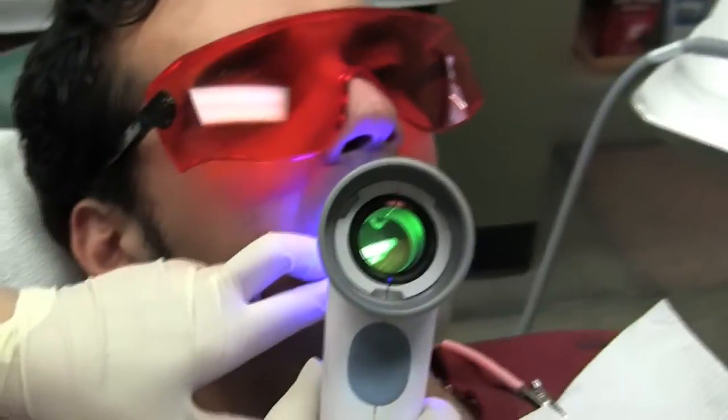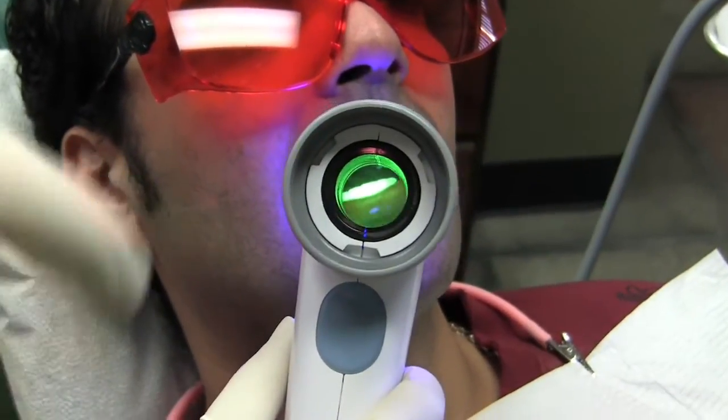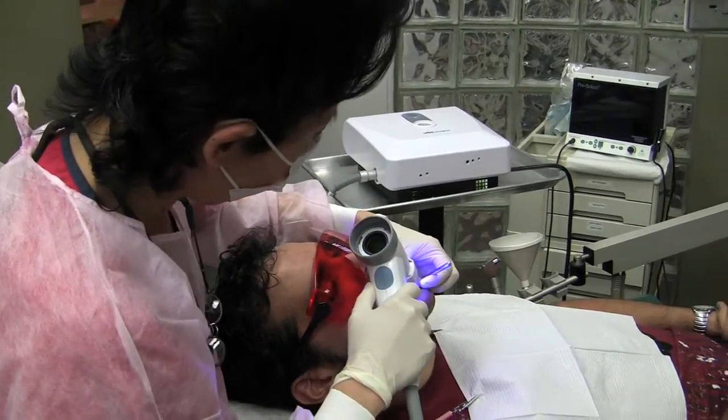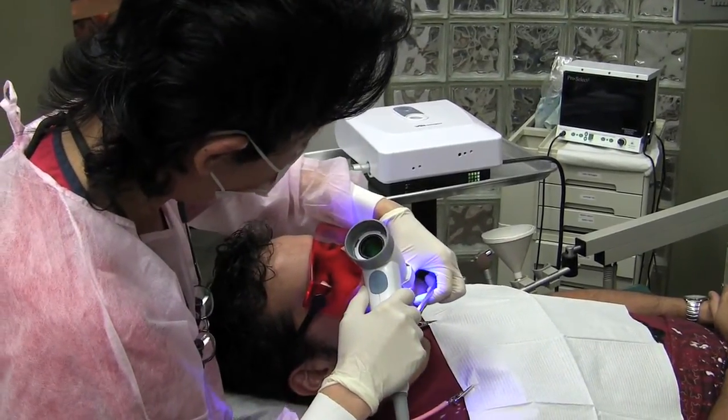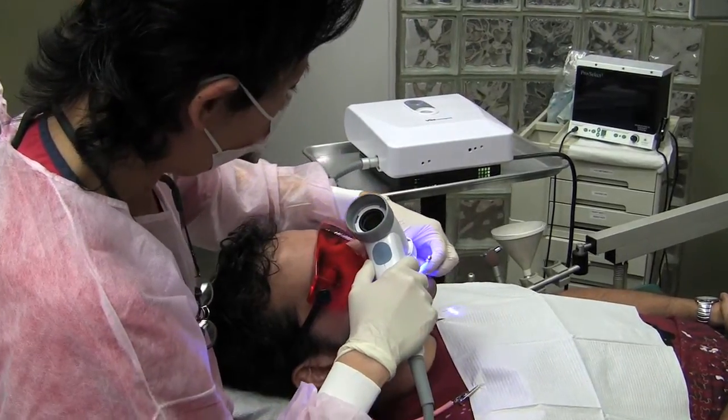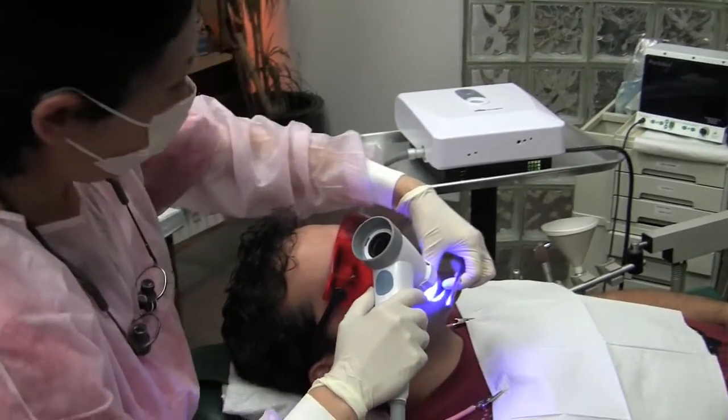You go through this blue fluorescence technology and look through the scope. I can see through this screen and tell whether the fluorescence color falls into the normal or abnormal range.